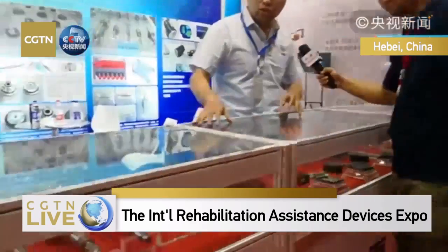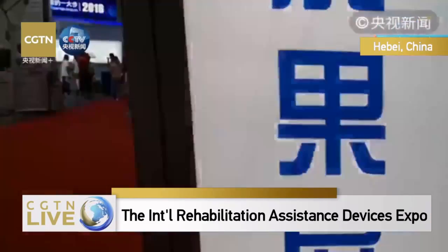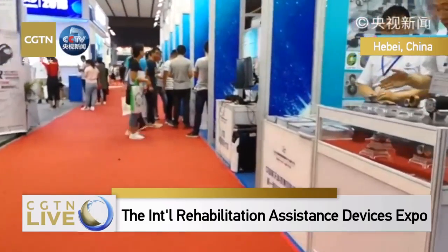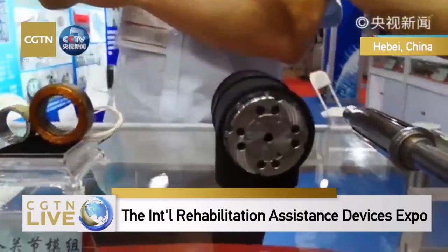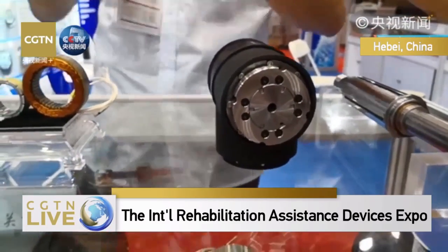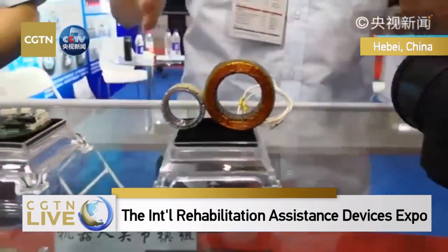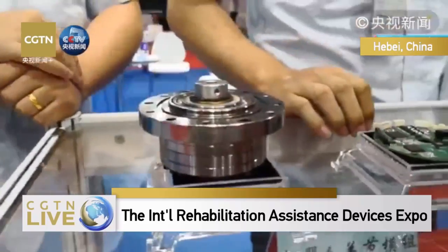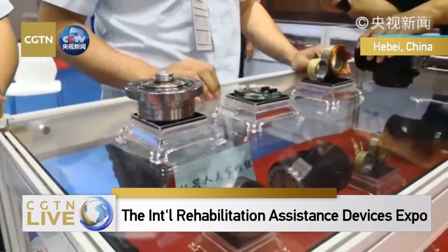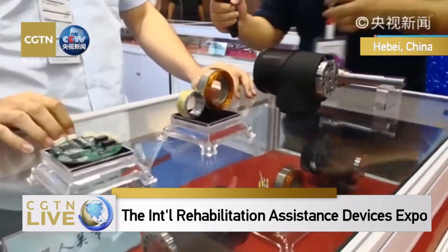This is a robotic joint. It can help with the mobility of the robots at the joint. Here is what we call a joint module. That is to say, it can be attached to all of the joints on the robots. We are in charge of the R&D of this module and provide it to the robot manufacturers.